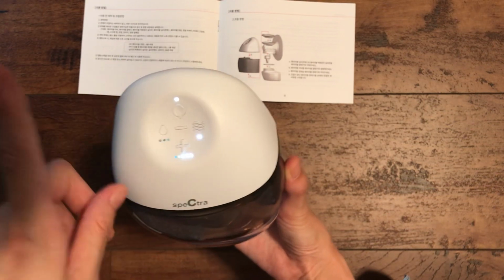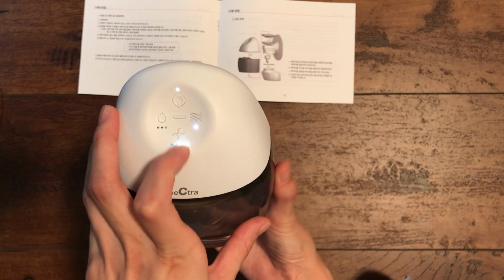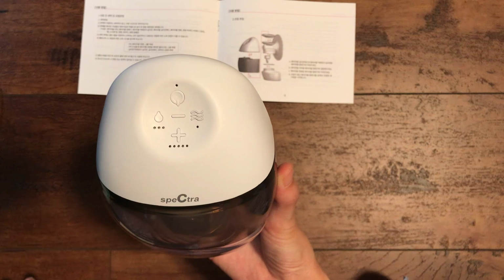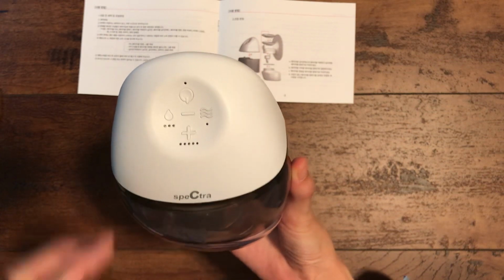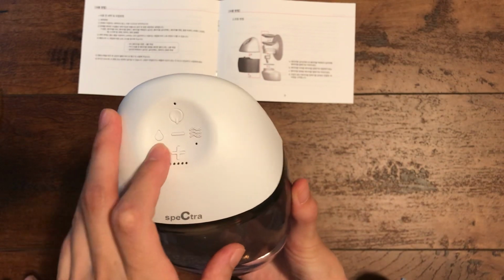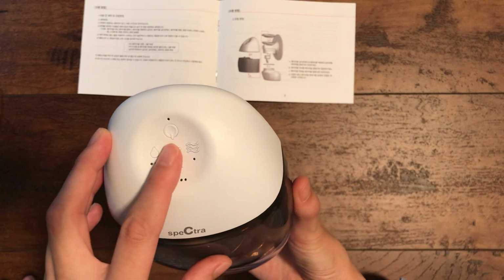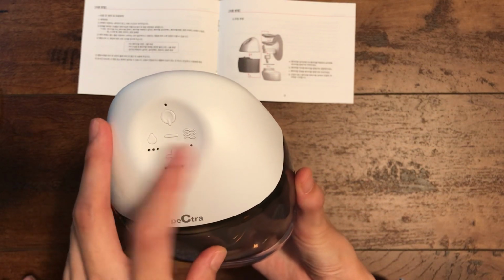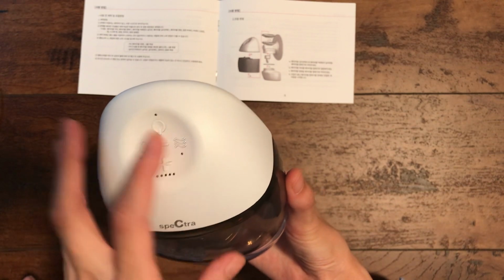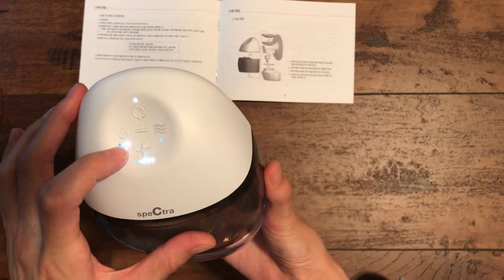There's only one mode for massage, only one pattern. You can just adjust the intensity. So that was the massage mode, and after that, you can do the expression mode. Honestly, you can go straight to the expression mode. It doesn't really matter, is what I found personally. But if you feel like the massage mode helps with your letdown, you can definitely start with that for a couple of minutes. After that, you can go to the expression mode.